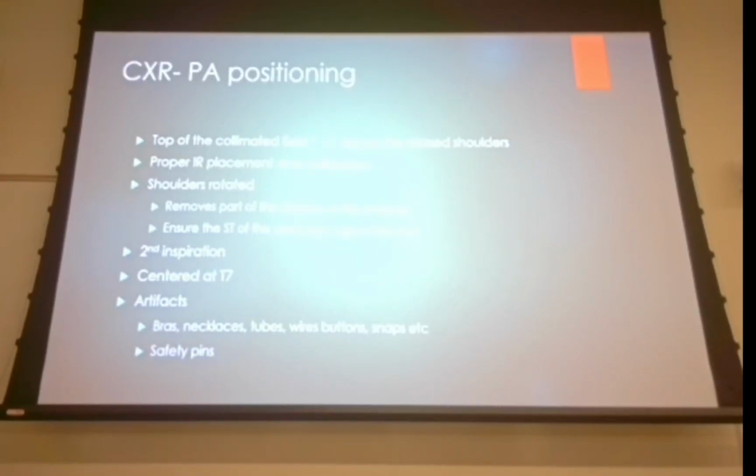So we're not going to spend a tremendous amount of time talking about positioning. You should have that by now. We'll talk about the things that you need to keep in mind all the way through the registry, the positioning points and things like that. That might have just slipped away, right? Because it's been a year since we've done this, so some of those positioning points might have slipped away. So we'll touch and brush over the general positioning, but for the most part, we're going to focus on image correction.